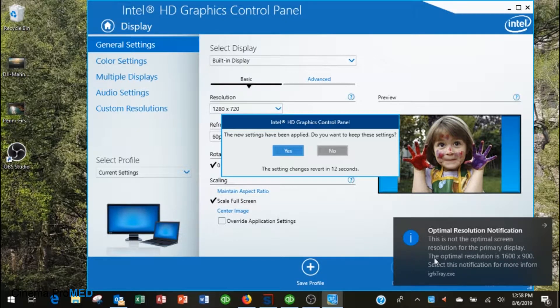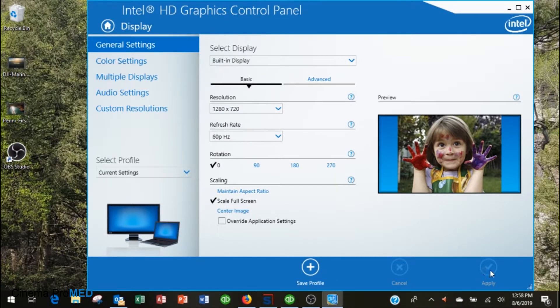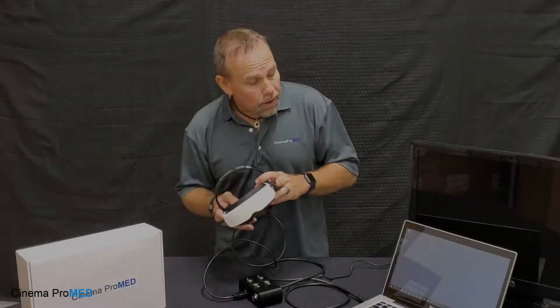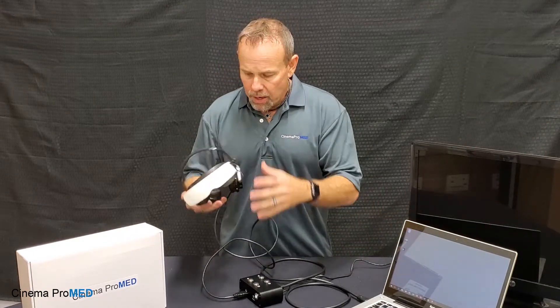Once those settings are correct, click Apply. More than likely you'll get an error saying this is not the optimal resolution for this display — that's fine, go ahead and click Yes to save these settings. Close out, and now the machine is set for 720p — 1280 by 720 at 60 Hz. As soon as we connect the Cinema ProMED through the HDMI, it'll be working great.